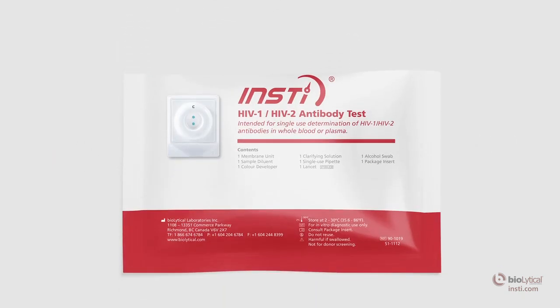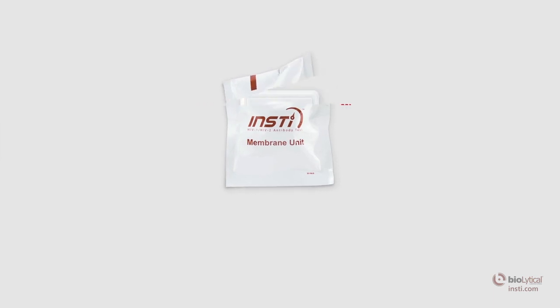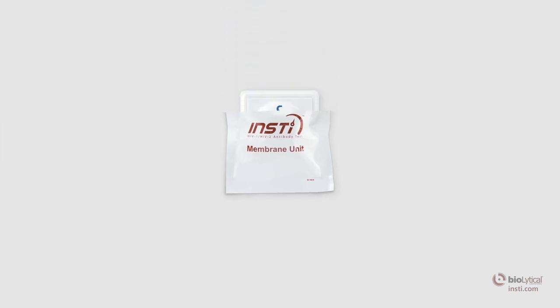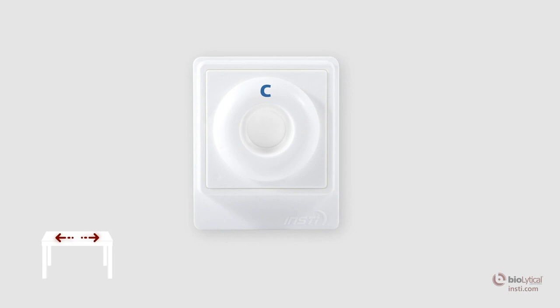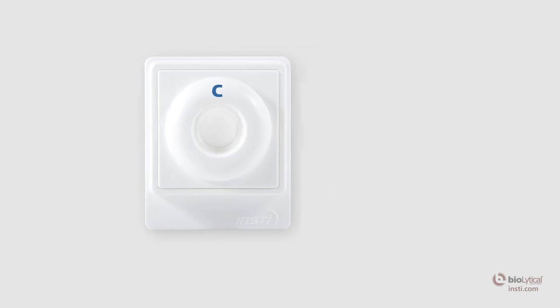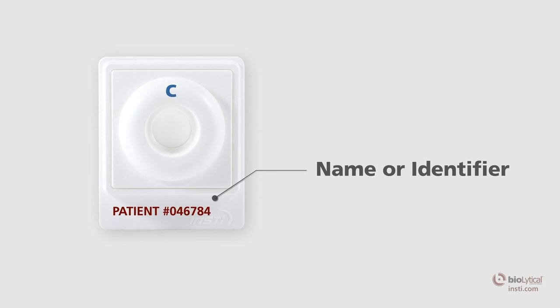Open the INSTE package and remove all contents from the pouch. Tear open the membrane unit pouch at the pre-cut edge and carefully remove the membrane unit without touching the center well. Place the membrane unit on a level surface, making sure the tab is oriented towards you. For sample identification purposes, the tab may be labeled with the patient's name or identifier.